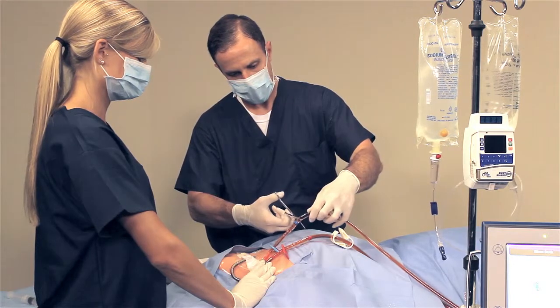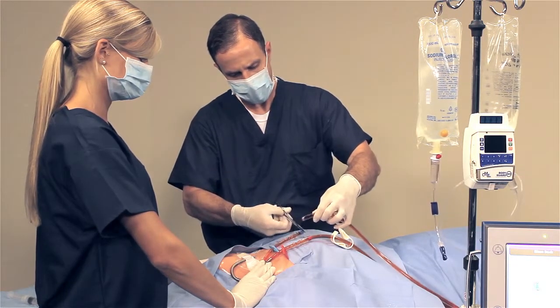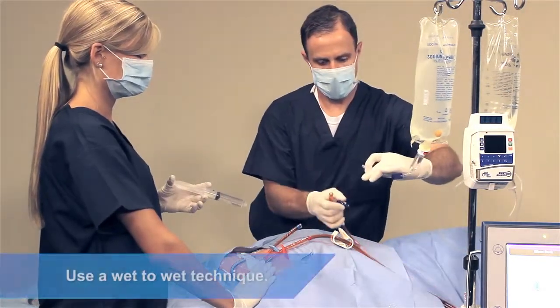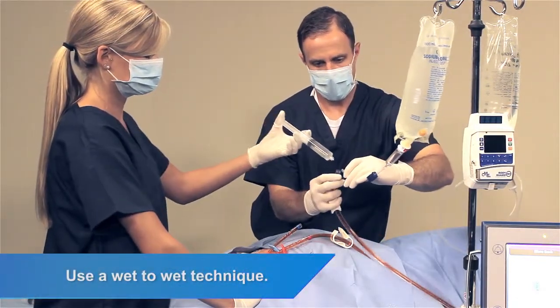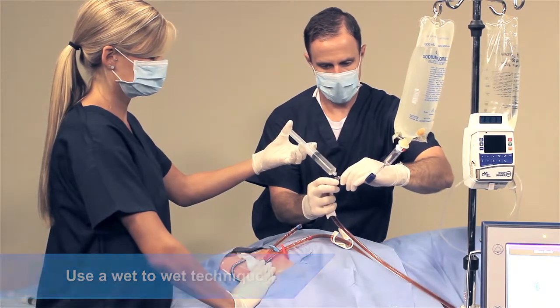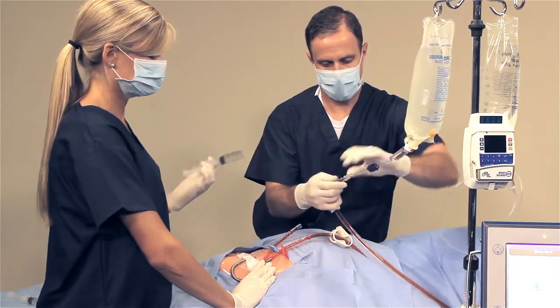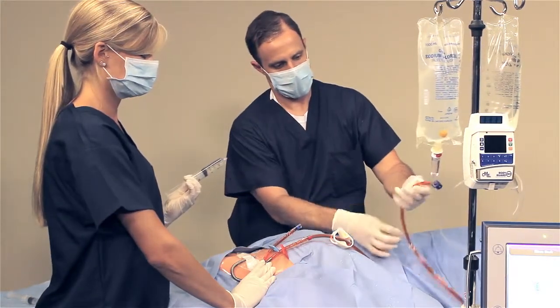With both clamps closed, cut the blue tube between the clamp and the catheter barb connector in the previously cleaned area. Using a 30 ml saline filled syringe, provide irrigation for the connection of the priming spike barb connector and the blue tubing. Ensure there is no air trapped in the tube.